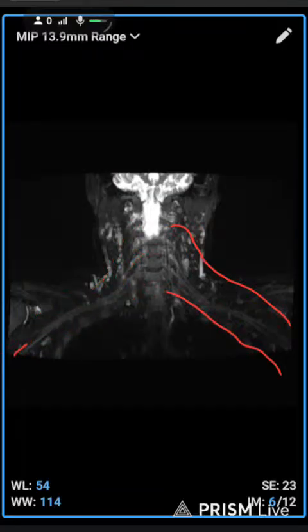It's called brachial plexus. If patient has some type of weakness in upper limb, or there is pain in movement in upper limb, so the type of history indicated that there is a problem in the brachial plexus, so it's an important scan.